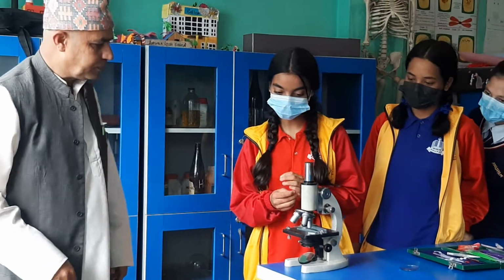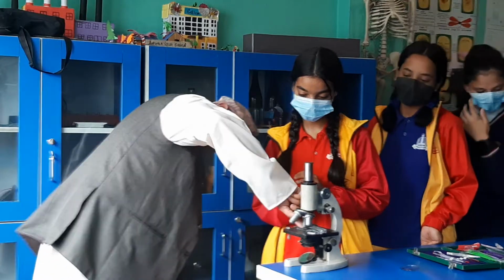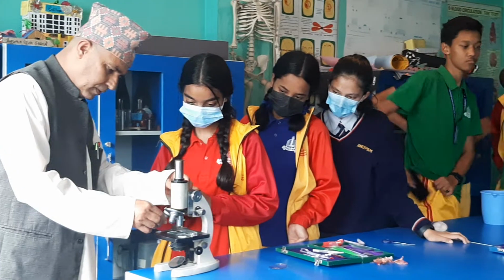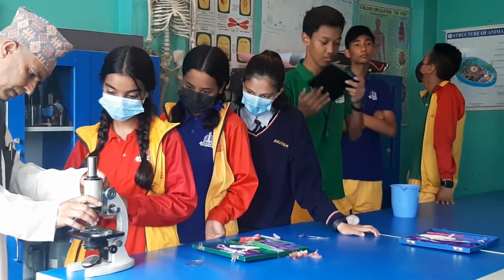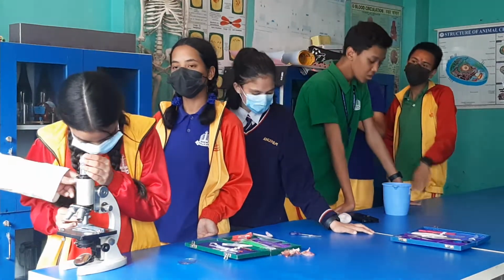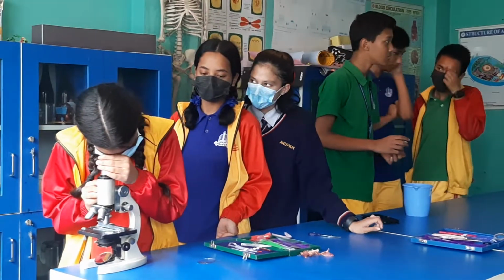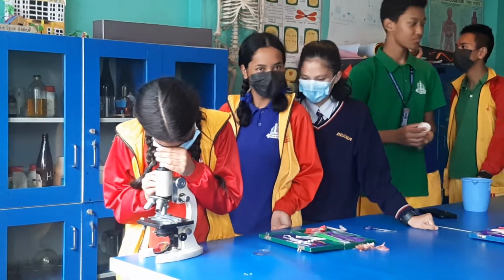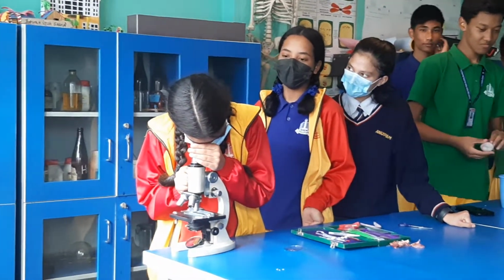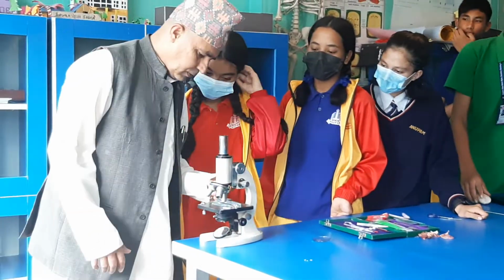Okay, change the lens, no problem. To change the lens, you have to just rotate. I think for that you have to move this up. This way. Adjust. Can you see? If so, for that you have to move up and down. Yeah, move up and down and check. You have to learn. You go up, you can go down also. If you rotate right, it goes down. Nothing seen? Okay.